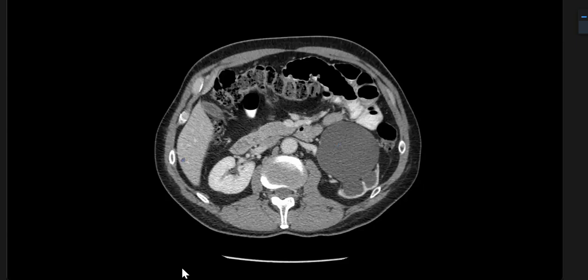And now, when I showed you the MAG3 renogram, there were two things which I would like to point out. I'm giving you this feedback so you don't commit this mistake in the exam. So when I gave you this, this was the first screen in front of you. And what does it say on the tin? On the tin, what does it say? Renogram. Screen is not available, sir. Not available. Okay.